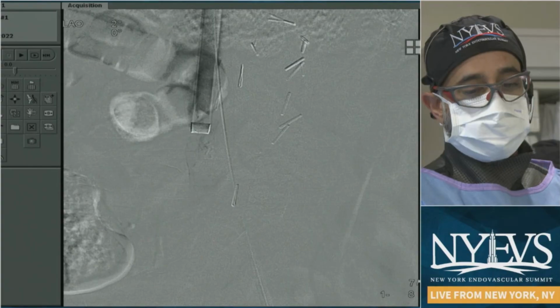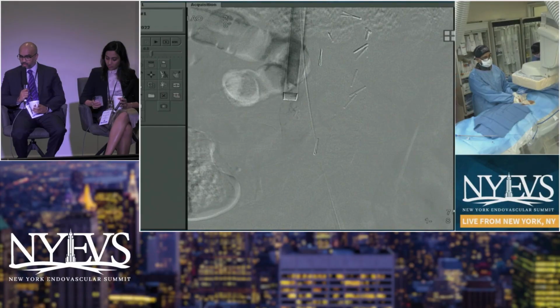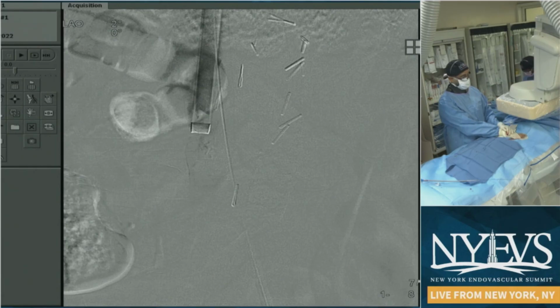I was just going to add that there are some filters that have reported data about higher embolization and fracture, and this is one of them. So it would be useful to get this one out. Yeah, just as a side, I already got an email from his lawyer.